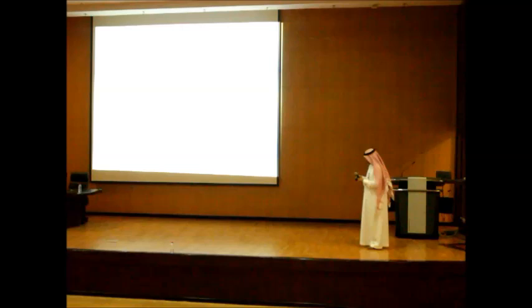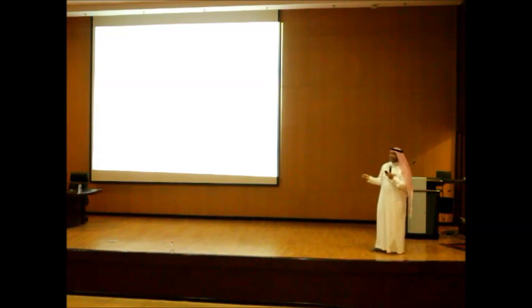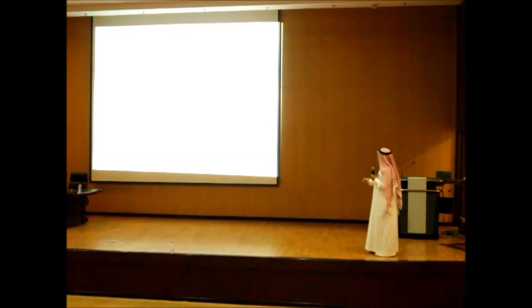And we'll take examples. So we look at the ECG. First we have to look at the patient name. We look at the date and the time, because this is very important if you have a patient coming with chest pain. And we look at the standardization. So this is 2 large squares, and the speed is 25 mm per second. So this is a standardized ECG.